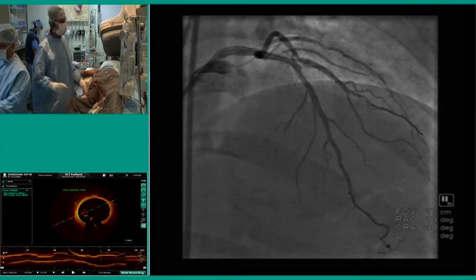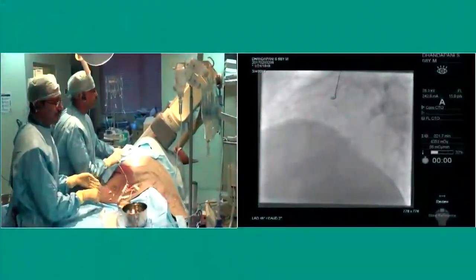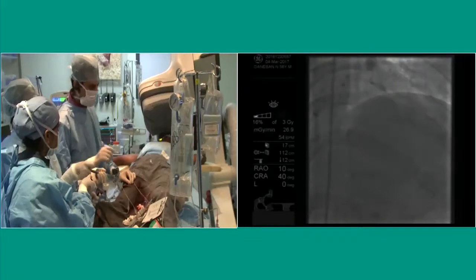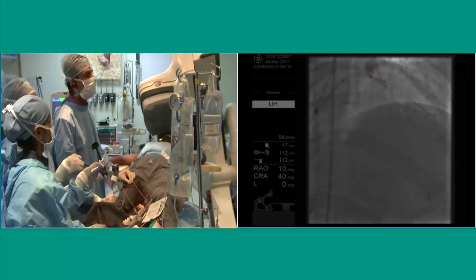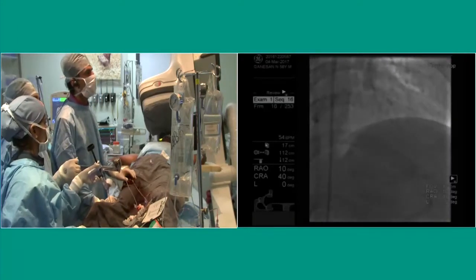Can you go to the other lab and come back, because Ajit is ready? Okay. Dr. Sengottuvelu, you are live now, and you can explain what all you have done. Both negative. Okay, can you go back to the previous picture, the last? So you've decided to do a kissing balloon?